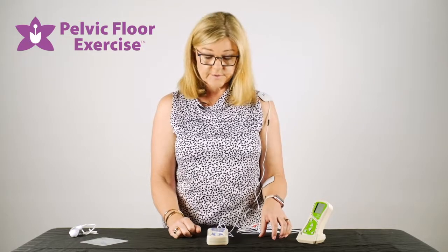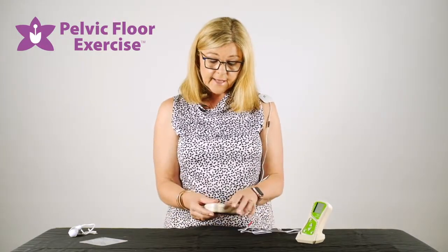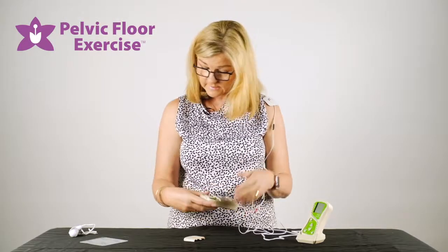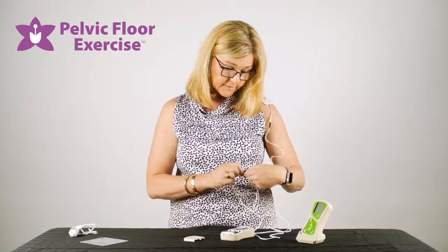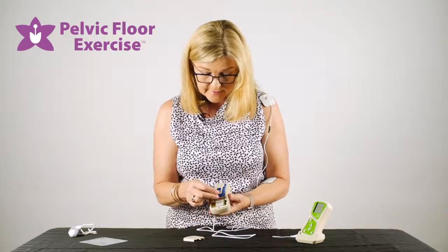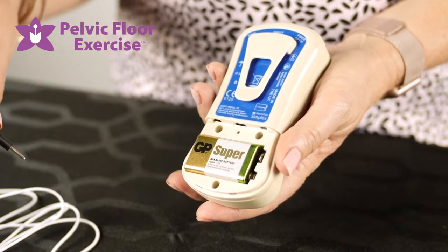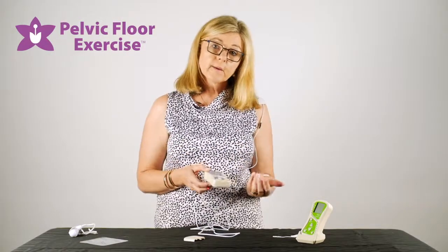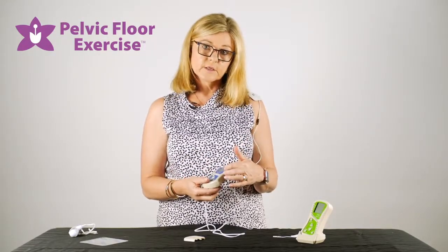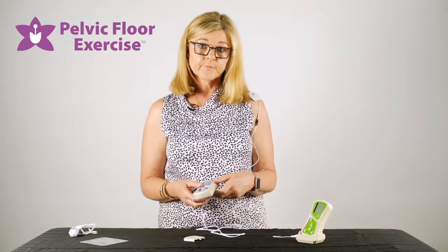If you're loaning one of these to a patient or they have their own to use at home, you can lock the device once you've set your program up. Take the back off and use the pin — there's a little hole in the middle; press something into that and you'll hear a double beep, which locks the device. Your patient can take it away for a couple of weeks to do their sessions. When they come back in, you can unlock it and run through the stats on the screen to see whether your patient has been compliant and how well they've been doing.